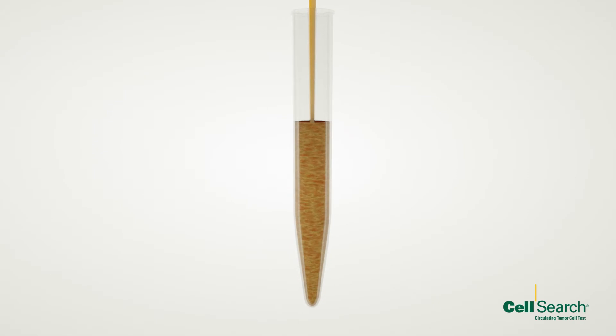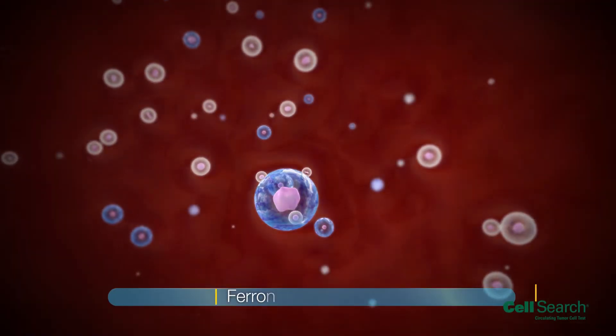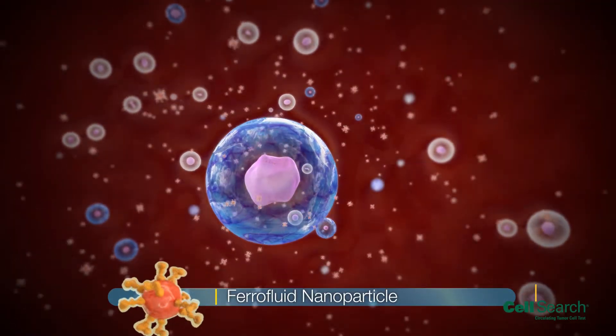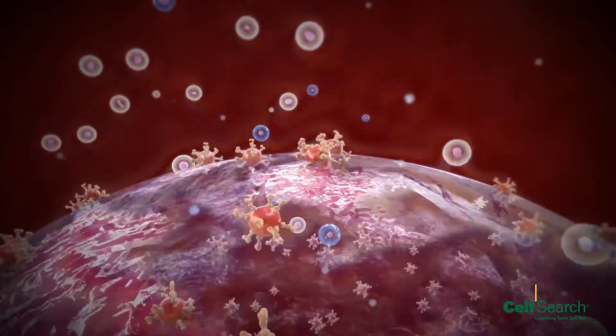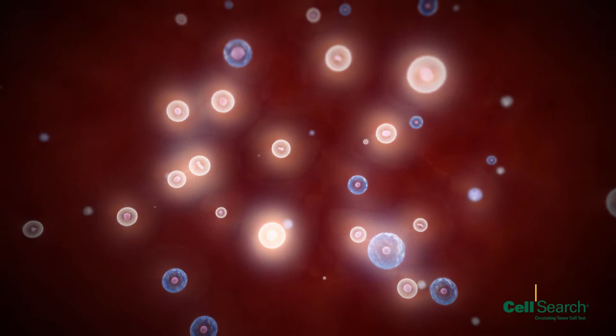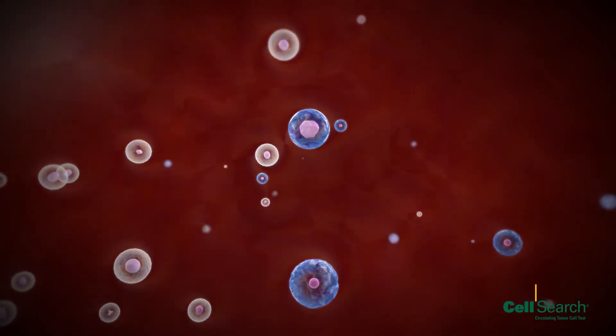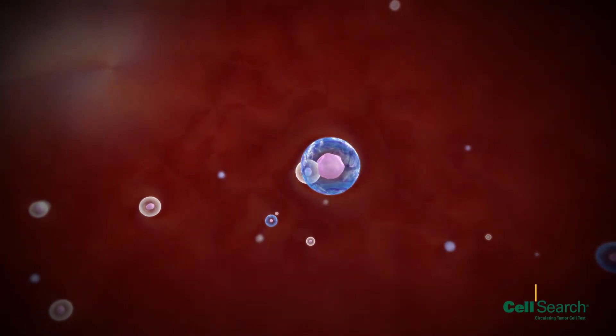CTCs are then enriched using ferrofluid coated with antibodies targeting the epithelial cell adhesion molecule. Tumor cells of epithelial origin are thereby magnetically separated from the bulk of the cellular material within the sample.